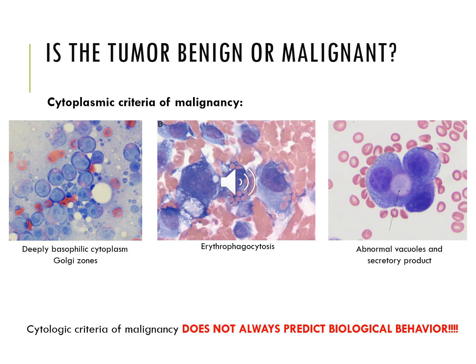Usually cells that have more basophilic cytoplasm are producing more proteins. They're more metabolically active because, again, they're dividing more rapidly. They need more proteins in their cytoplasm to account for that. And so they typically take a more basophilic appearance, which is just not good overall. So that's one thing that we might look for.